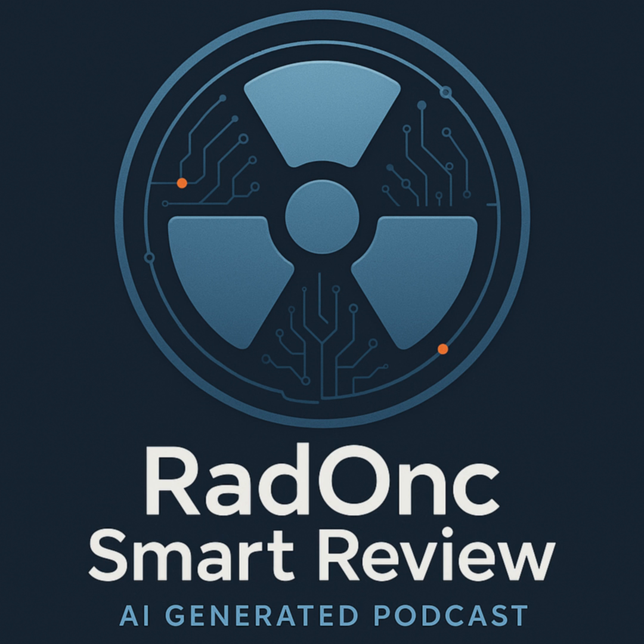Right. That sounds like, well, a recipe for trouble if you're trying to put two electron fields right next to each other. It absolutely is a major planning challenge. That outward bulging of the low isodoses, combined with that widening penumbra we just talked about, is precisely why matching adjacent electron fields, or matching an electron field to a photon field, is so notoriously difficult. Because those bulging low doses will overlap. Exactly. If you simply abut the field edges on the surface, those bulging low-dose lines from each field will overlap significantly at depth, creating potential hotspots well outside where you thought the field edge was. And if you leave a gap to avoid the hotspot, then you risk creating a cold spot, underdosing the tissue at depth between the fields.